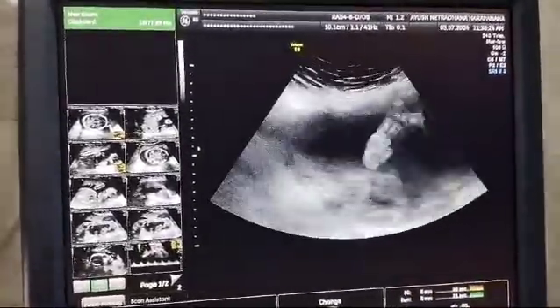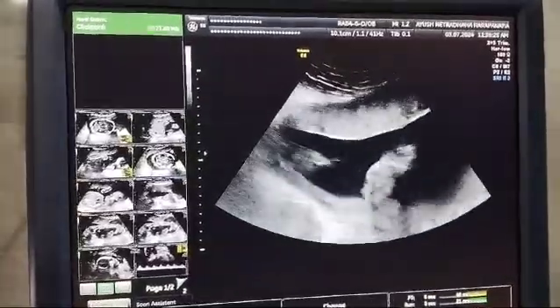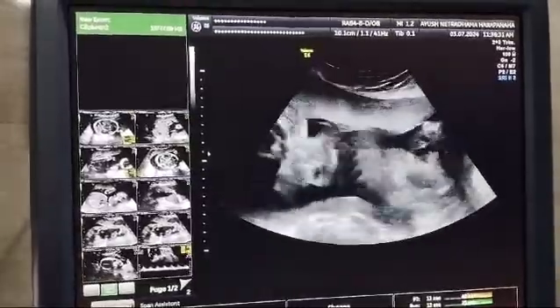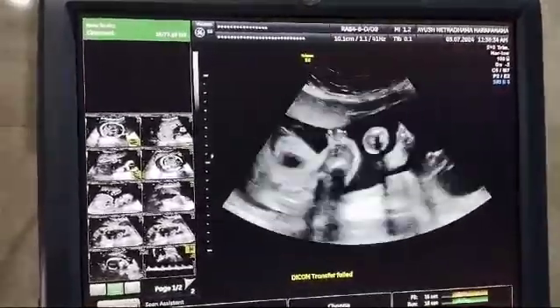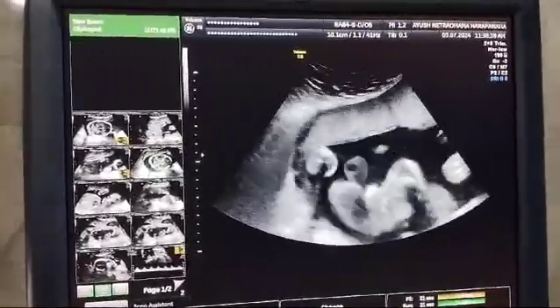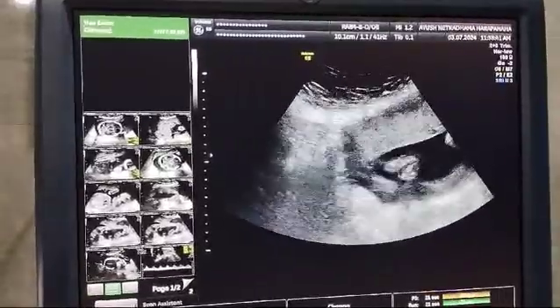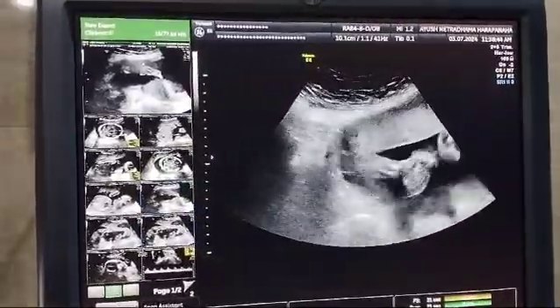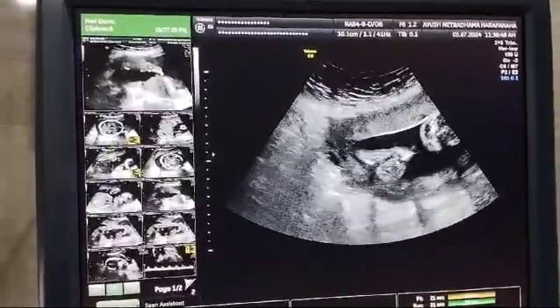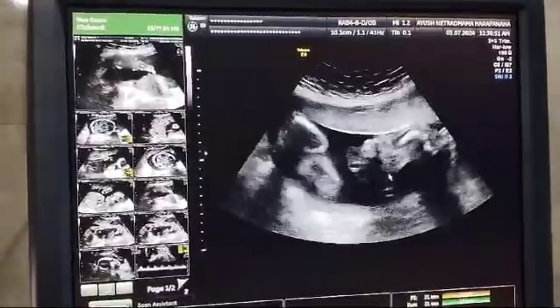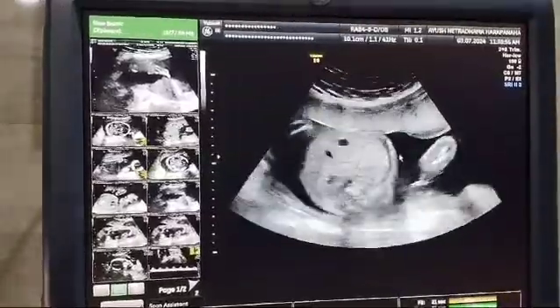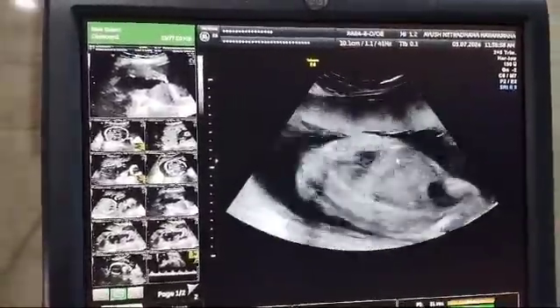Visualizing the foot is a very important aspect of an anomaly scan and early first trimester scan, where we need to look at the relationship of the foot with the ankle and the leg. When we try to look at the tibia and fibula here, this is the tibia and fibula, and this is the foot which is having equinus deformity. We won't be able to get that typical view of the foot — instead there is a curvature.